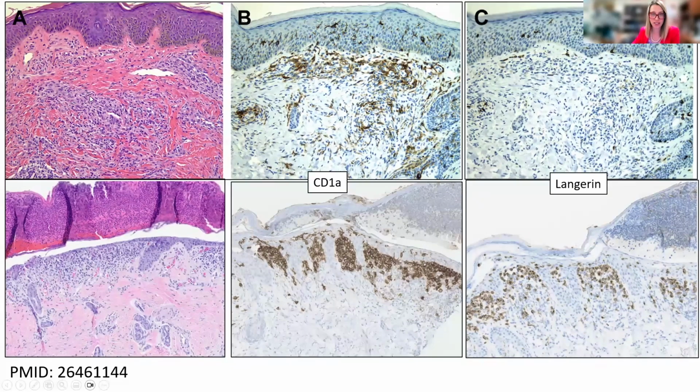You can tell that there's histiocytes. It's a pinkish look. There's ample cytoplasm, but it's really hard to see the exact cell type. And when we stain this, it has this more dendritic or spindled population. It doesn't have this epidermotropic pattern. And even in indeterminate cell histiocytosis, it basically should still have the pattern of LCH and filling up that upper dermis. So this is actually a case of reactive dermatosis.